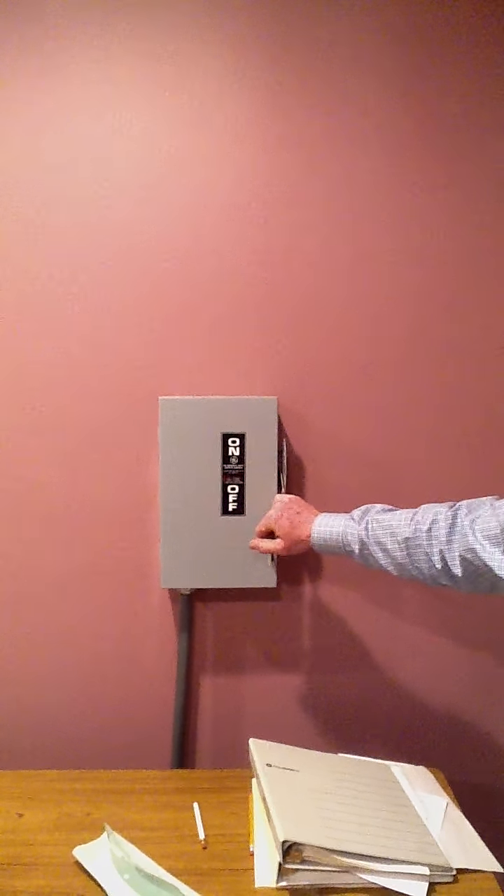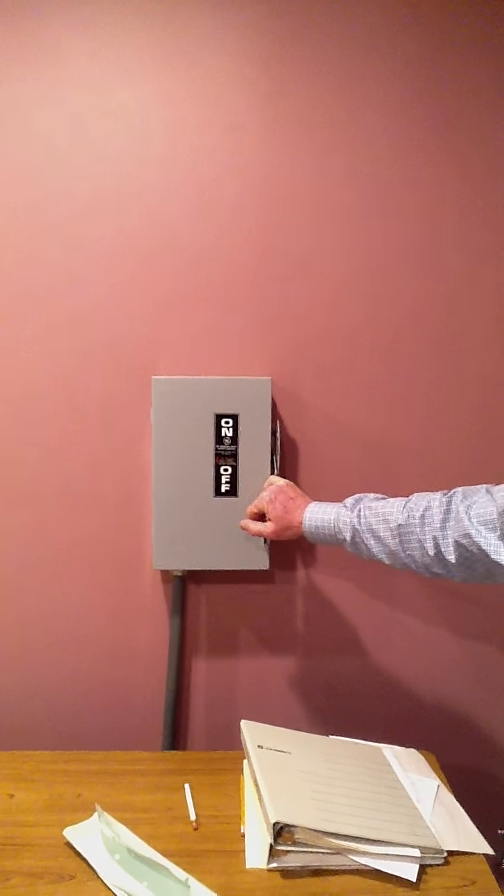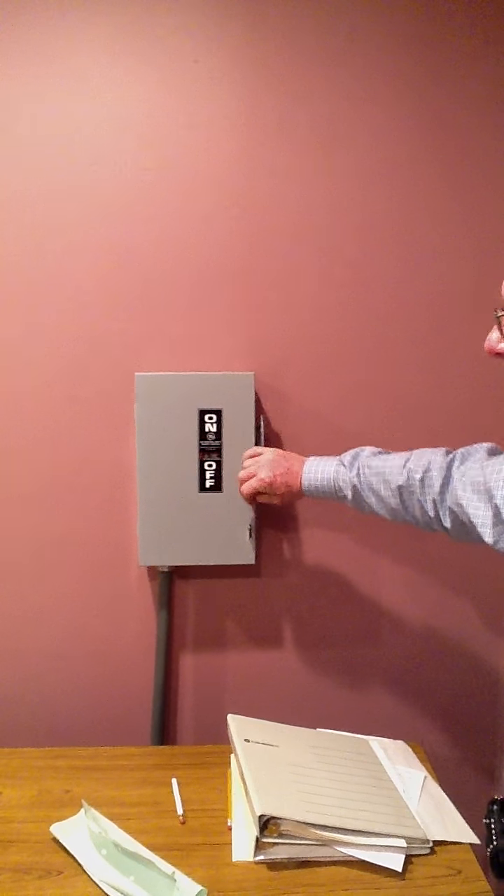I'm going to go over the procedure for starting this 900 series coherent argon laser. First thing we do is switch on the power supply. This is a 220 volt, three phase electrical supply.